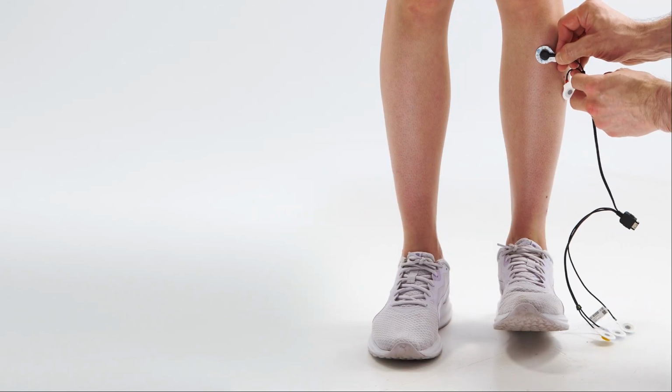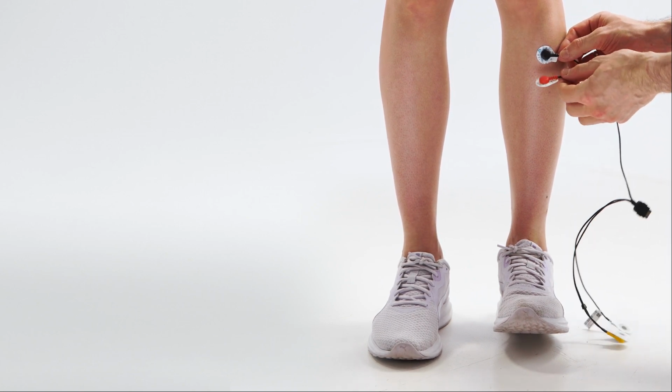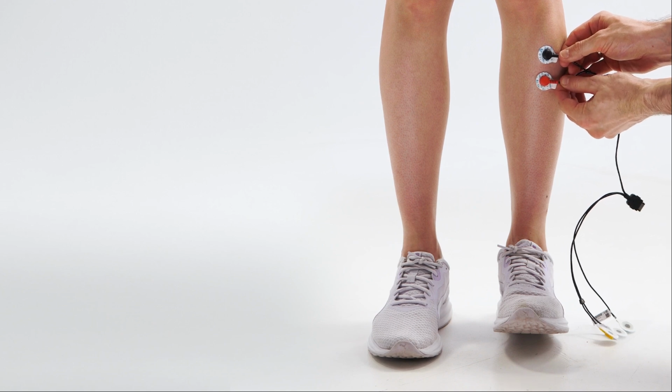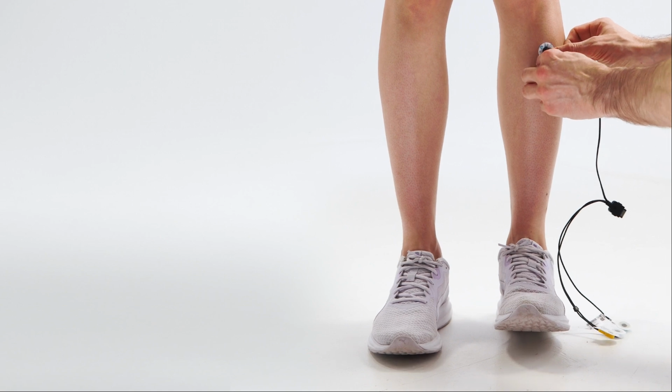Steady Step is a system for analyzing gait function. The Steadies allows you to study the parameters of walking to assess the functional state of the patient's musculoskeletal system or analyze the effectiveness of the conducted rehabilitation.